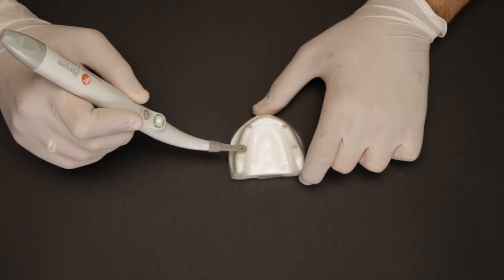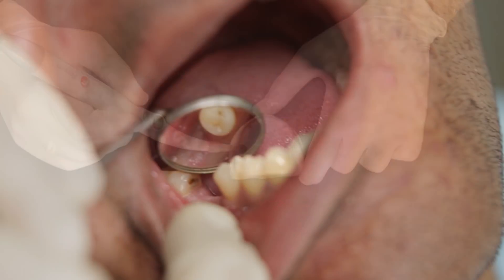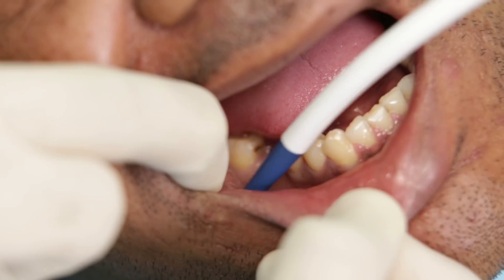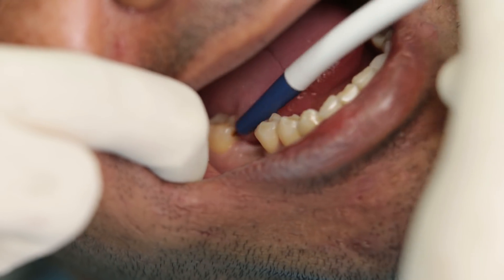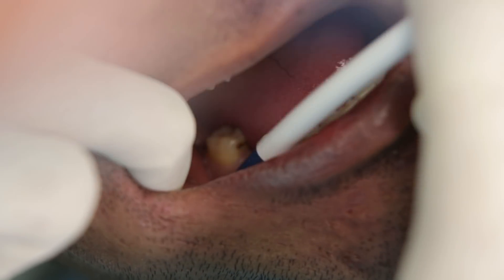So let's go ahead and see how we use the implant locator on our live case. This is a case where I have placed an implant in the 4-6 region a few months ago. I am highly satisfied by the healing and it's time for the second stage surgery now.